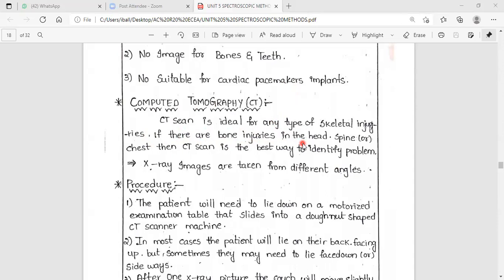హెడ్లోని మన బ్రెయిన్లోని ఏవైనా ఒక డిజార్డర్ ఉందనుకోండి, కంటైనింగ్ సమ్ అబ్నార్మాలిటీ జస్ట్ లైక్ బ్లడ్ క్లాటింగ్ కానీ బ్రెయిన్ ట్యూమర్స్ కానీ ఆర్ బ్రెయిన్స్లో ఏమైనా వెజల్స్ మన వెయిన్స్ ఏమైనా వాటి సైజులో డిఫరెన్సియేషన్ వచ్చినా, ఓకే, ఏదైనా హార్మ్ఫుల్ నేచర్ ఉన్నా కూడా లైక్ దట్ ద అబ్నార్మాలిటీ ప్రెసెంట్ ఇన్ ద సెంట్రల్ నర్వస్ సిస్టమ్. నేను మళ్ళీ చెప్తున్నాను, ద అబ్నార్మాలిటీ ప్రెసెంట్ ఇన్ ద సెంట్రల్ నర్వస్ సిస్టమ్ విచ్ ఇస్ డిటెక్టెడ్ బేస్డ్ ఆన్ దట్ సిటీ స్కాన్.